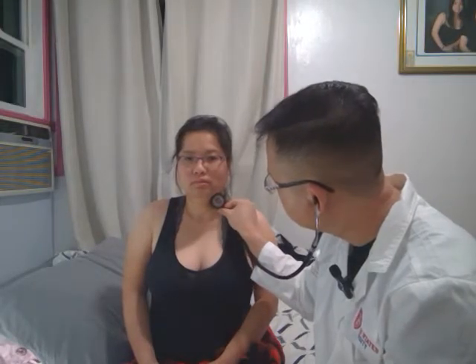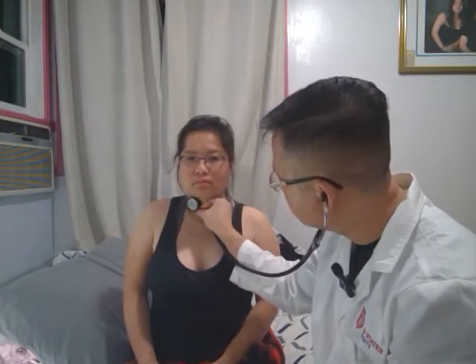Then I change to the bell. So I hear the heart sound there, but there is no bruit, there are no turbulent sounds, there are no obstruction sounds on the carotid bilaterally. So that is the neck area. Right now we're going to go down to the chest area.